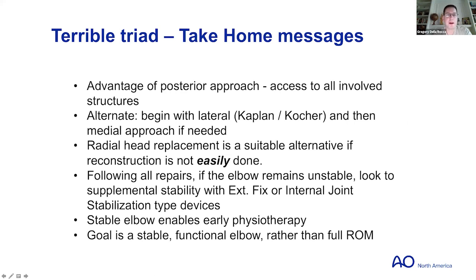I think I put them on a little bit more frequently maybe 5 or 6 years ago, but now if I'm going to put an X-Fix on, I'm more likely to put patients into a static frame. And I don't have to do that very often either. I'm looking forward to trying the internal joint stabilizer, but at the same time, I'm not looking forward to it, because if I'm turning to it, then it means that the elbow injury is just brutal. And I prefer not to have to take care of a patient with that bad of a problem.